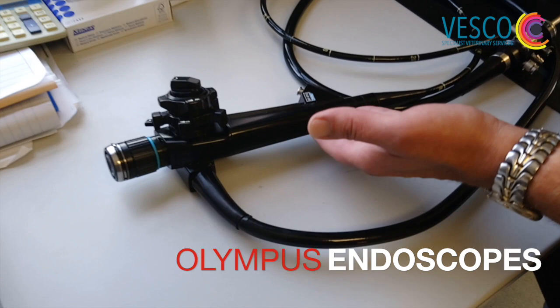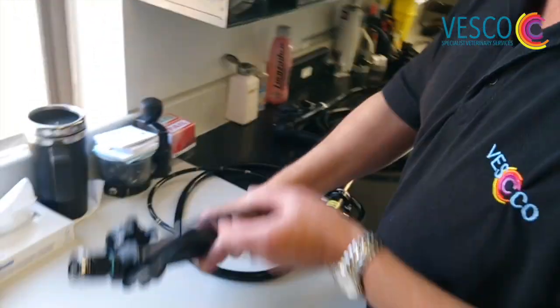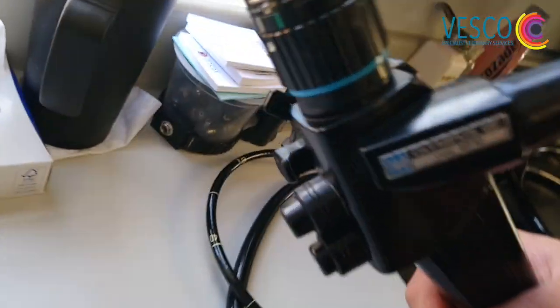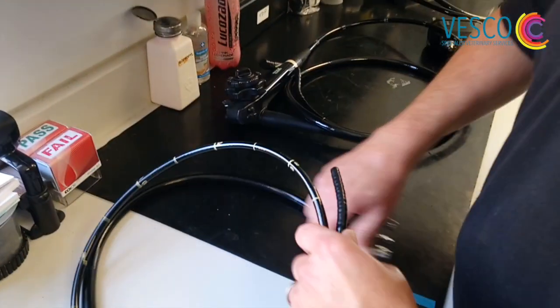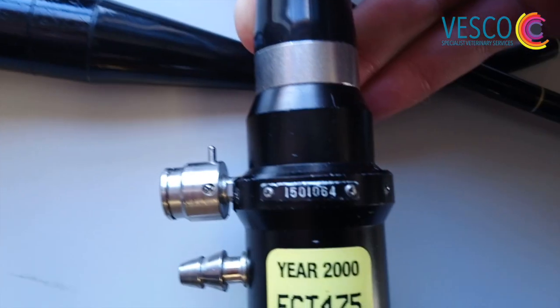If you look around the biopsy port there, you will find the identification badge. Sometimes it can also be on the back of the light guide tube here. The individual serial number for each scope is usually found at the end of the light guide tube — that's the serial number.